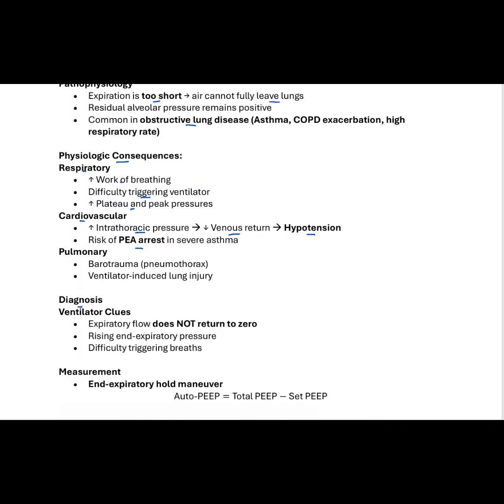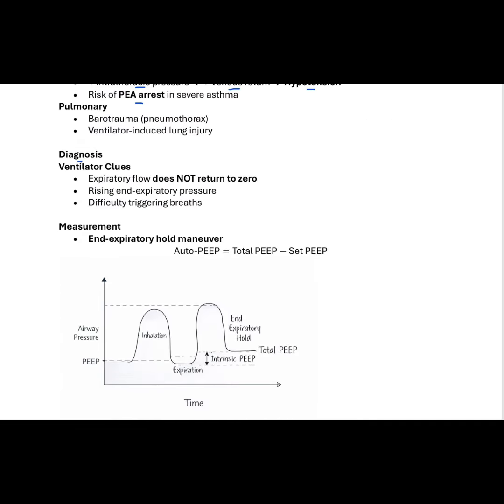So how do we diagnose this? Like we mentioned earlier, a couple of clues that you can look for is when you look at the expiratory flow, if it doesn't return to zero. That could be one clue, because when you look at the flow, for instance, let's say this is our baseline from the previous lecture, right? Let's say this is inspiration, and this is going to be expiration. Ideally it's supposed to return to zero. Then the next breath will be what? Delivered, right? So that's going to be inspiration.